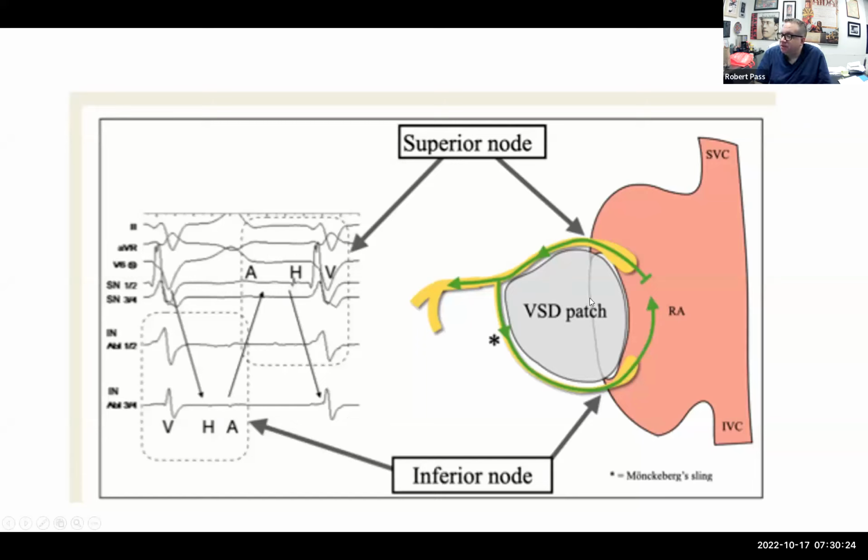And then typically what happens is that you ablate one of the nodes, usually the one that has less good conduction characteristics. Another proof of this is to pace near each of them and get a different QRS morphology. And that sort of cinches your diagnosis. Also, of course, recording an AH and a V in two different locations would be useful and helpful in making this unusual diagnosis.